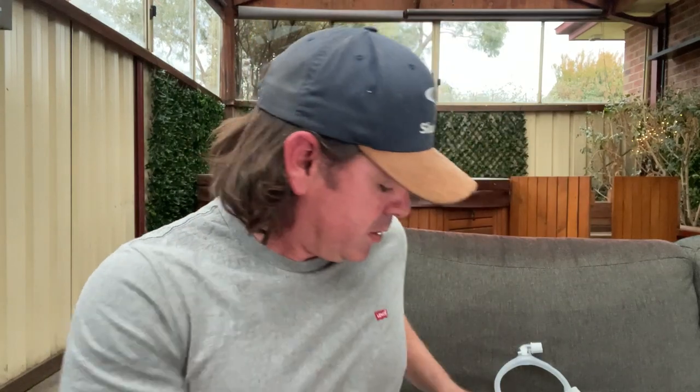Well, think about this. If you're someone with a pacemaker, your pacemaker's floating around down here, keeping your heart going boom, boom, boom, and you get this Philips Dreamwear full mask, and you read the manual and it says, it's okay, your pacemaker's more than 5 centimeters away from the mask clips. You're in the clear. We're like, great, no problem.